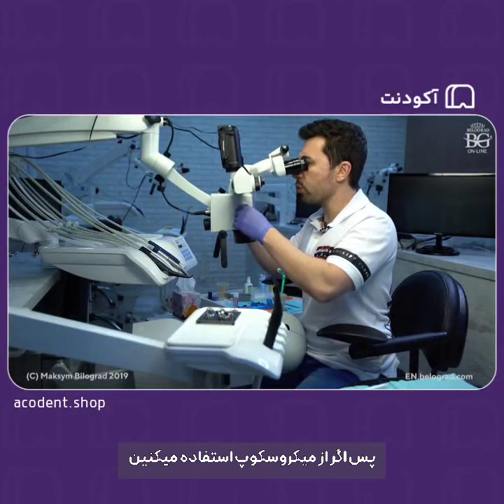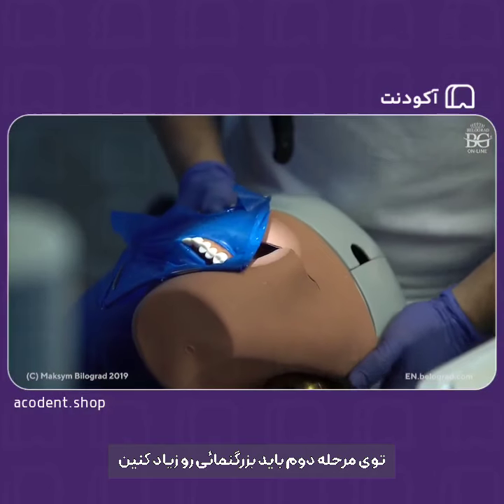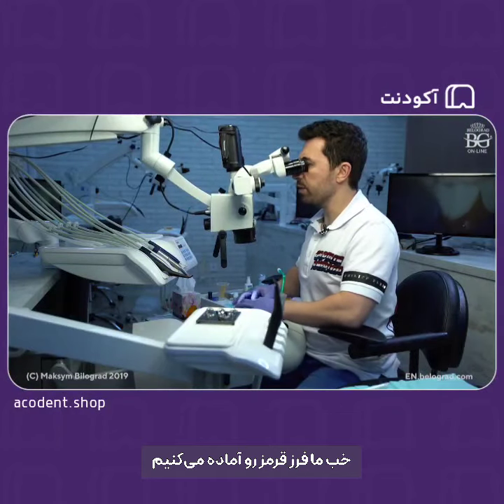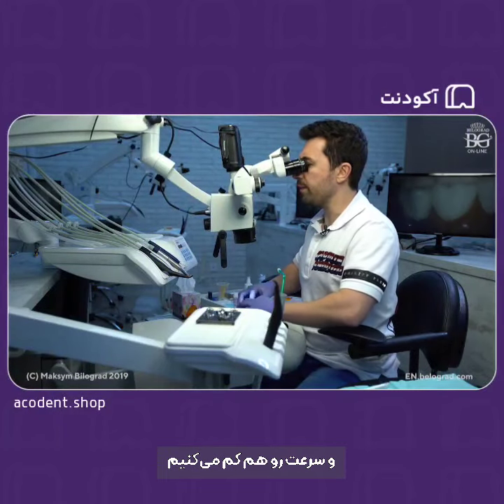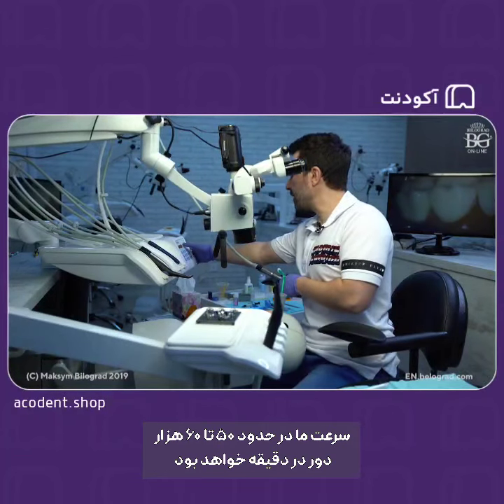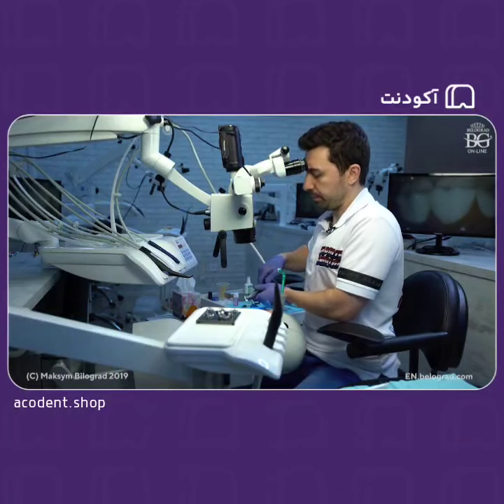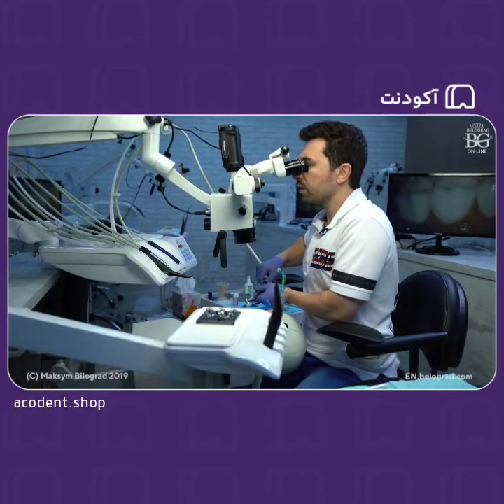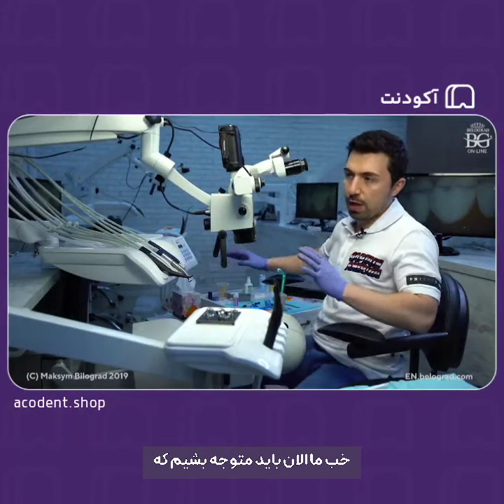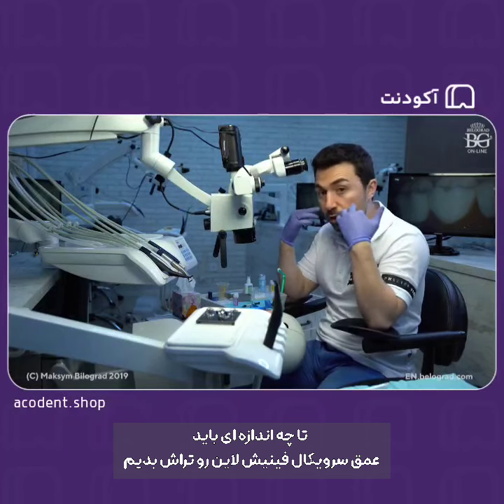Okay, so during the second stage of preparation, we will increase magnification. If you work with a microscope, you increase magnification. Okay, we put on the red diamond. We will also decrease speed. The speed will be about 50-60,000 RPM. I will also decrease the water amount. And I will prep the finish line. So we now have to understand how far we have to go with the finish line, the cervical finish line.